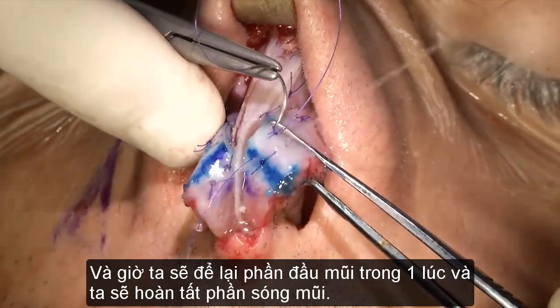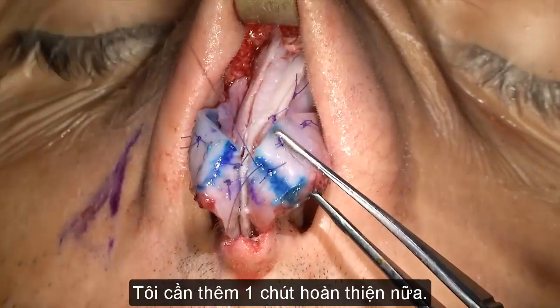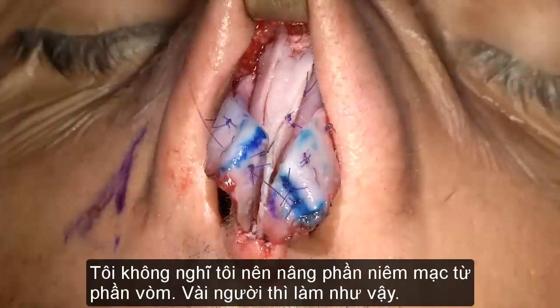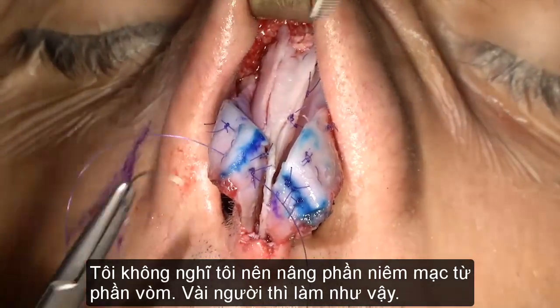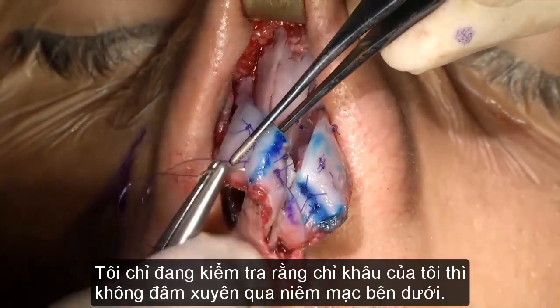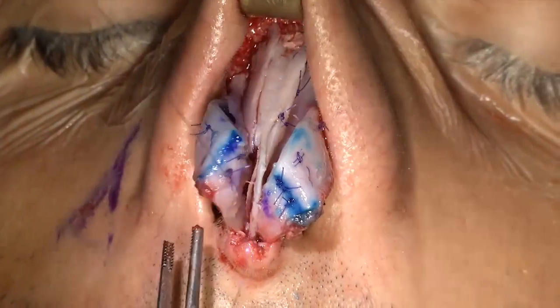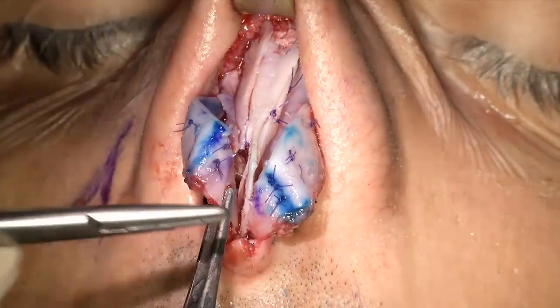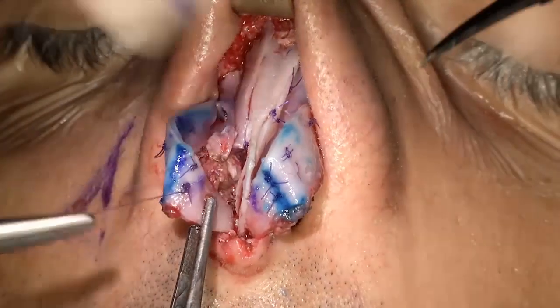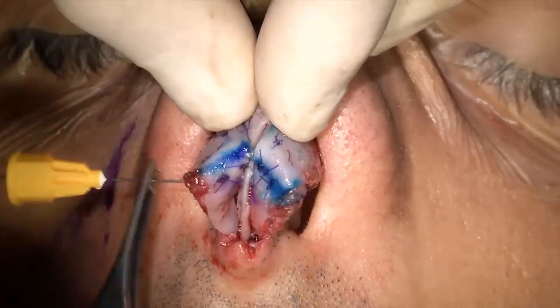So now we'll leave the tip for an instant and we'll finish the dorsum. I want a little bit more definition. I don't think I should elevate my mucosa from the domes. You know, some people do this. I'm just checking that my suture is not really penetrated.